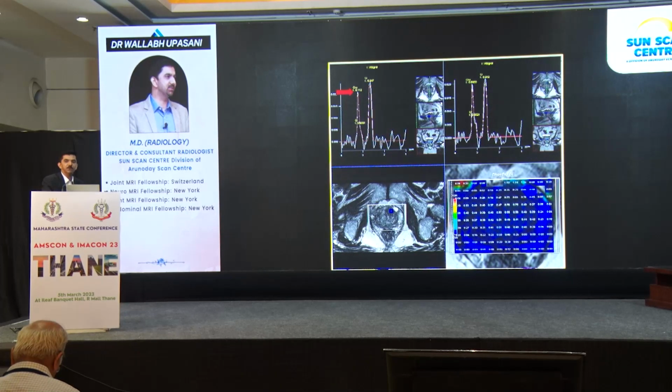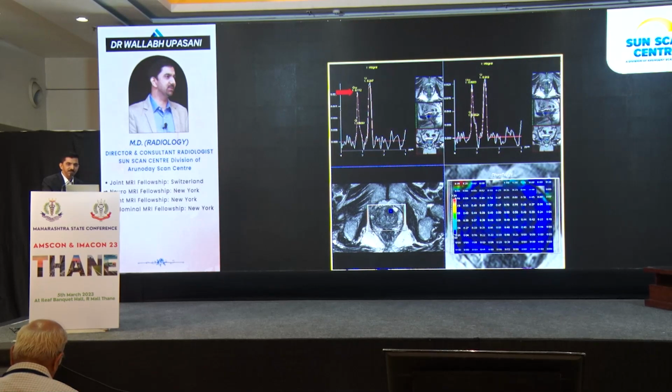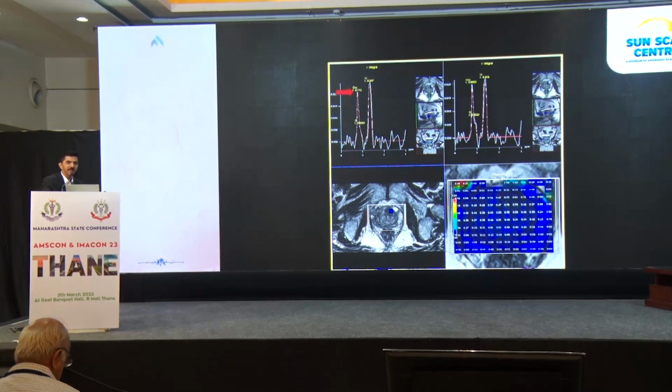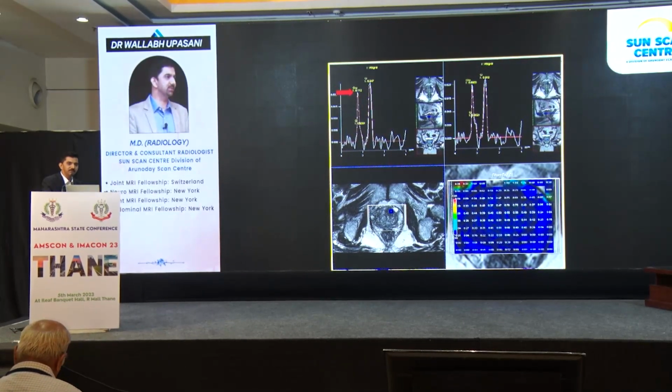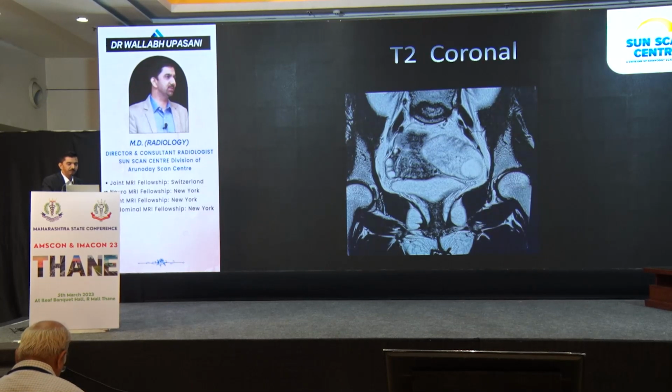So why do you need to do these techniques? That is because you can guide the person who is doing the biopsy, which area he has to target. Because even if they do multiple biopsies and go through only the benign area, it can still be missed. So therefore, it can guide the clinician who is doing the biopsy.